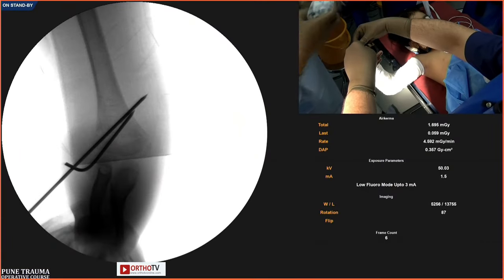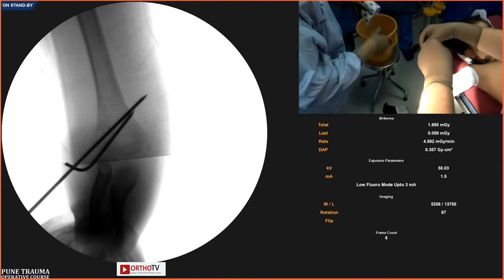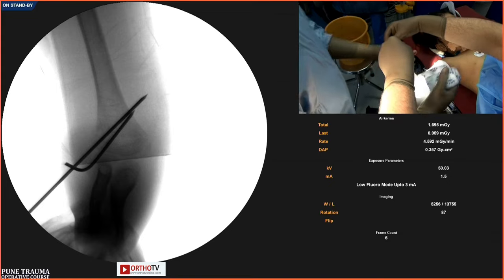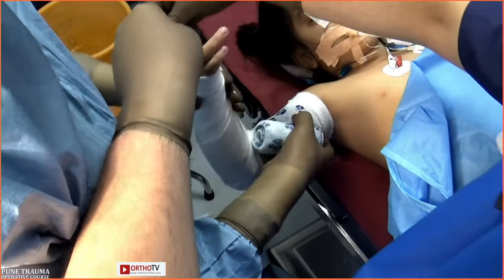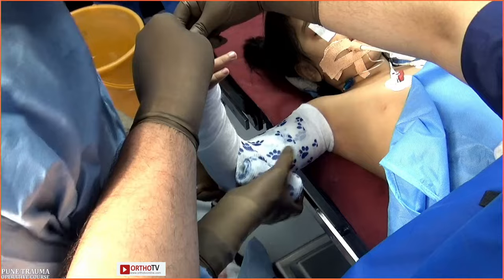This is the plaster material that I like to use. It is a semi-soft, soft delta cast. We just roll this, and it does not need a plaster cutter for removal. I don't use a slab. There has always been this controversy, slab or cast.